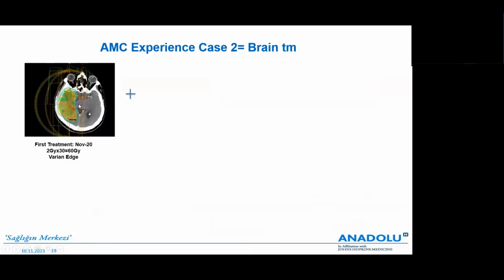And the second case, again for brain, but this time the problem is that there is an optic apparatus here, and also the brainstem is here, which means that I need to be careful for this.